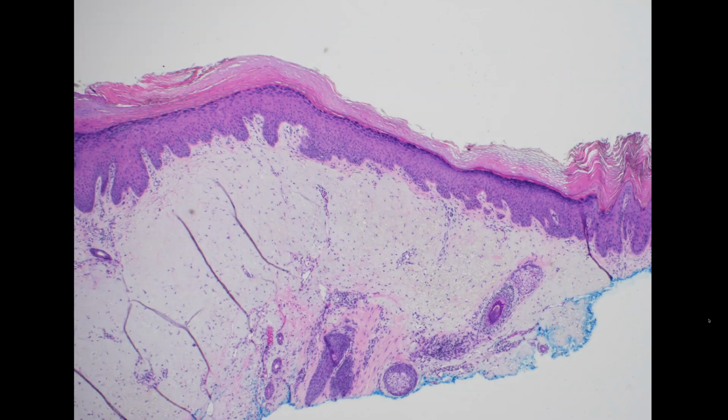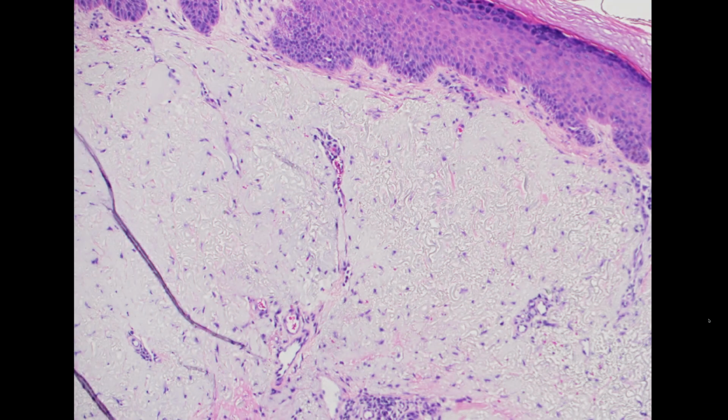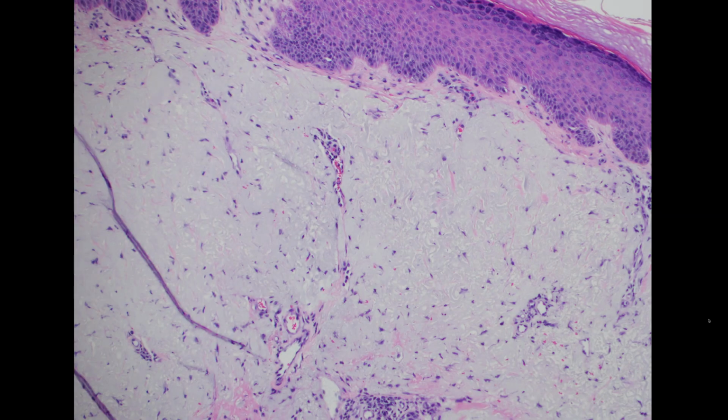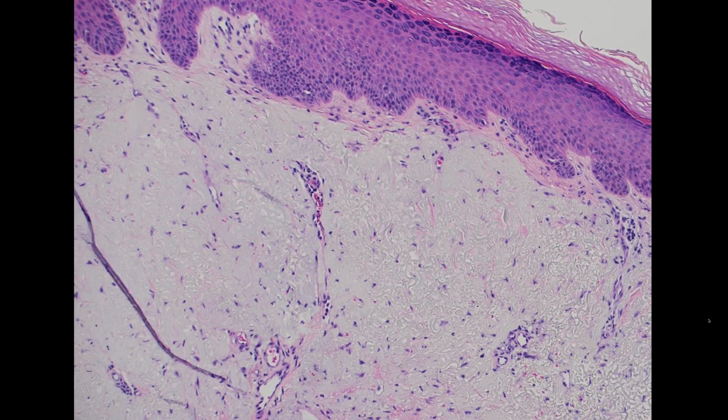And you can tell the patient has lots of sun damage because look at the dermis. The dermis is normally filled with pink collagen bundles, which would be about like this color. But in this case, the entire dermis here is replaced with this blue-gray kind of tangled fibers. These are elastic fibers. So this is solar elastosis, really severe solar elastosis. This is not the kind of change that you would get from going to the beach occasionally.